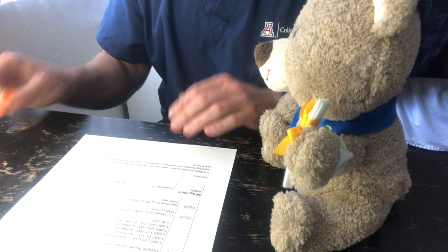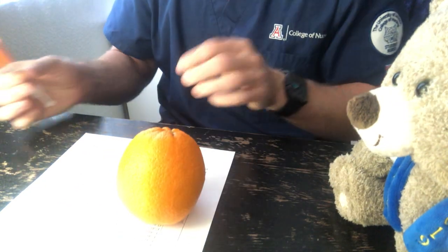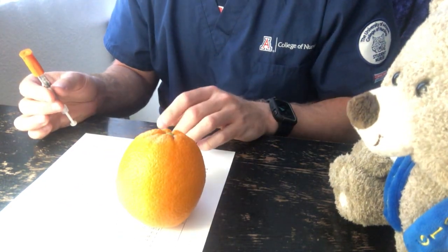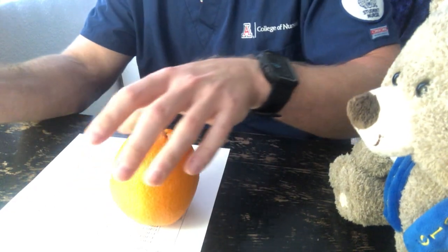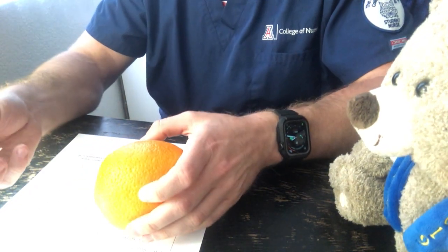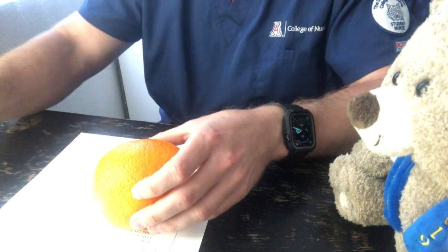So I go to administer again. Sorry, oh geez, sorry Marge. So I will be administering the sub-Q injection on the abdomen, 2 inches away from the umbilicus. But prior to doing that, I'm going to wipe the lid, wipe the appropriate area for 15 seconds. Again, 2 inches away from the umbilicus. Allow it to dry.